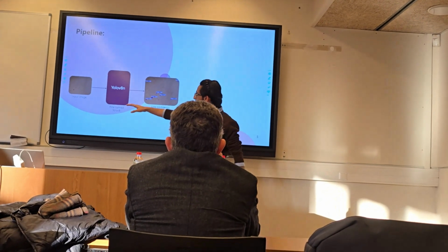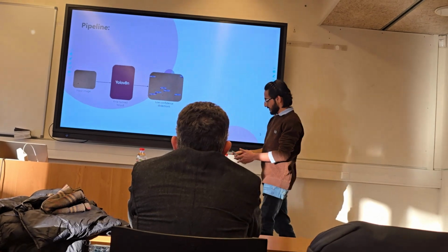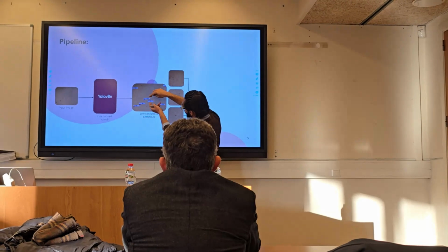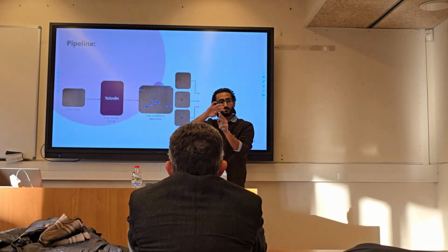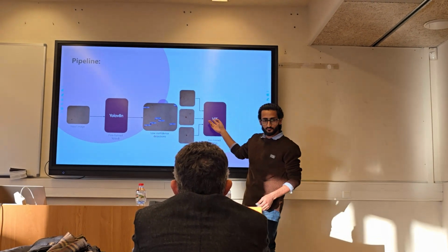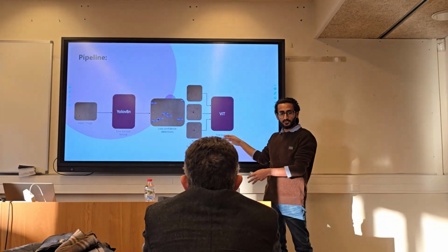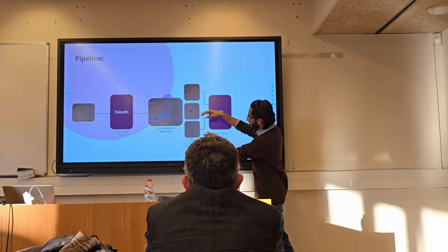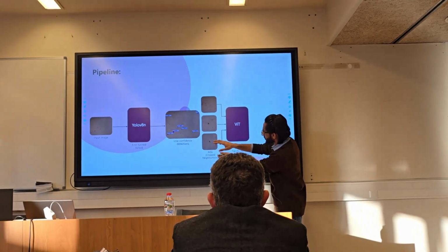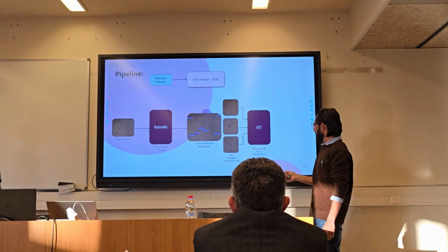Till here we were getting the detections with a low confidence threshold. After that, we probed the neighborhood of these lesions to get more contextual information, and then we used a vision transformer, because it uses attention layers, aggregates the features from the lesion, gets more contextual information, and then helps us to classify it.